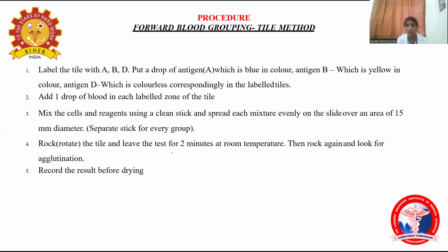Yes. So now that we are coming into a practical major thing, we have been introduced for the last 10 minutes. What are blood group systems, types of blood group system, Landsteiner's law, and what is the Bombay blood group, what are the various methods, what is the advantageous method. All these we have discussed, major, minor, Rh, antigen, everything. Now that we have come to practical proper, you should know the procedure.